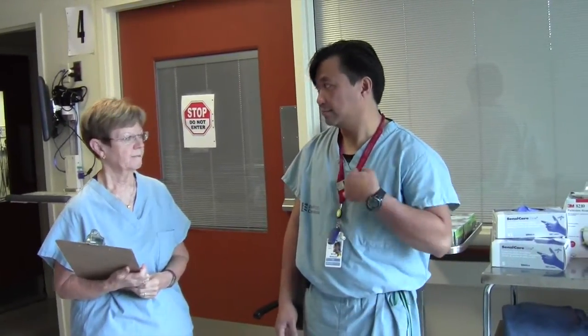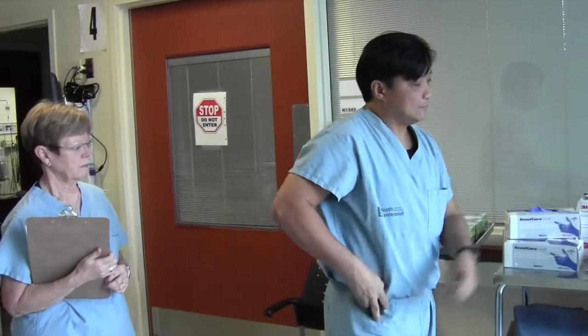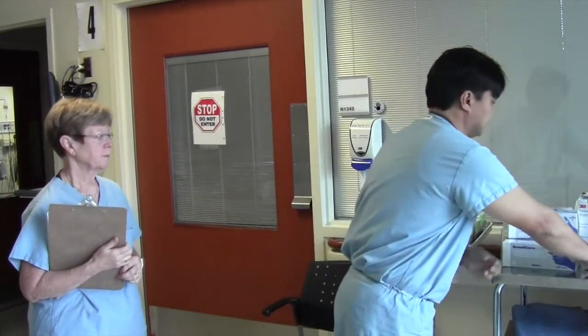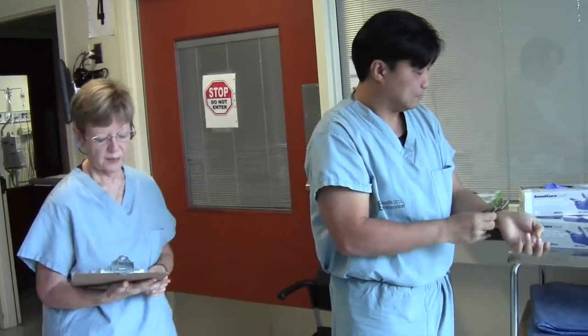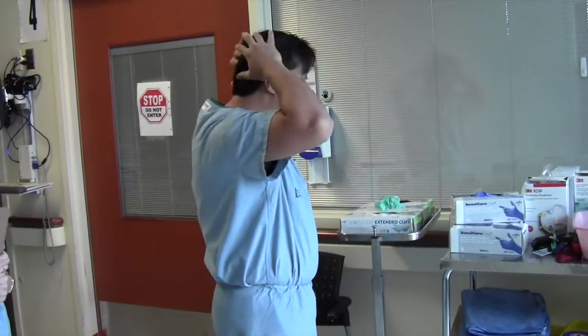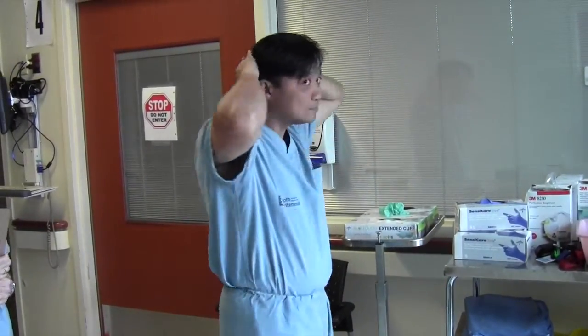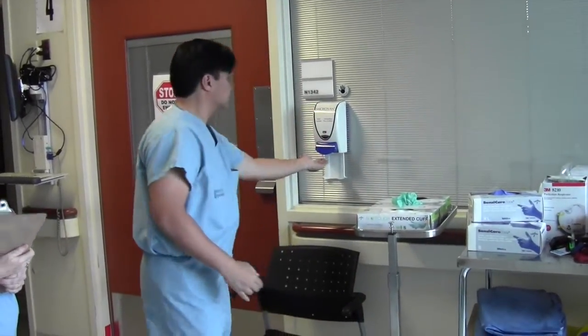Step 1. Prepare to don your PPE by removing all unnecessary items including lanyards, keys, pagers, and jewelry. These items will get in the way of proper donning and doffing and will also need to be disinfected if worn. Ensure that all hair is tied up. Fingernails must be trimmed — not only because long fingernails provide great hiding places for organisms, but long fingernails may potentially puncture gloves, compromising their protective ability. Complete Step 1 by cleaning your hands with alcohol-based hand rub.